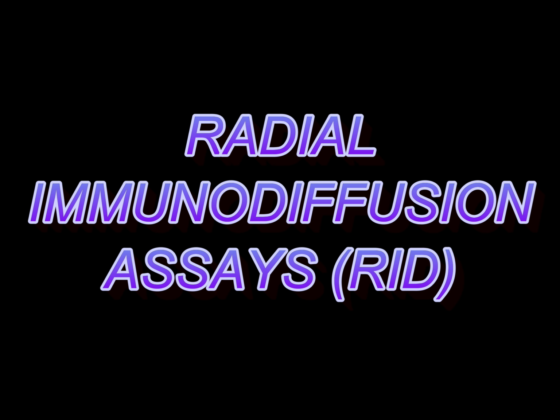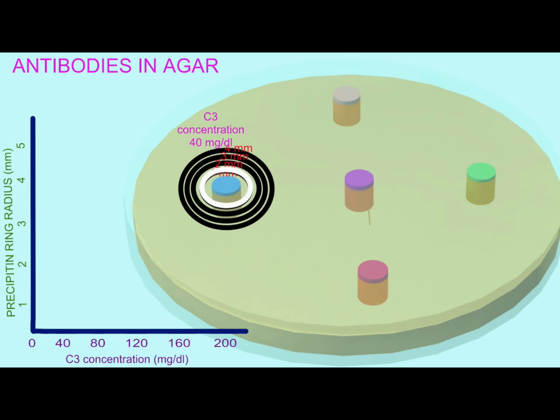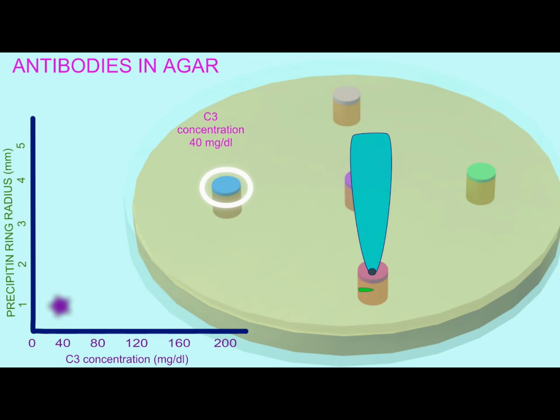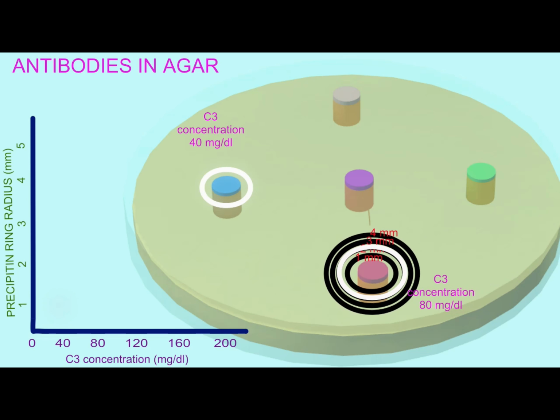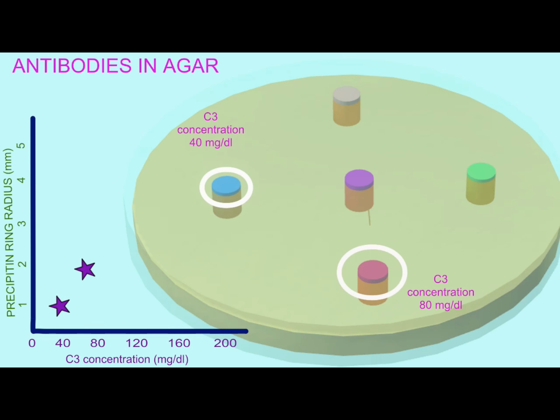In the immunoassay known as radial immunodiffusion, or RID, there is only one well for the antigen because the antibodies are added to the agar itself at a temperature appropriate so that the antibodies do not denature. As a result, the zone of equivalence will form a ring around the antigen if there is binding between the antigen and antibody.